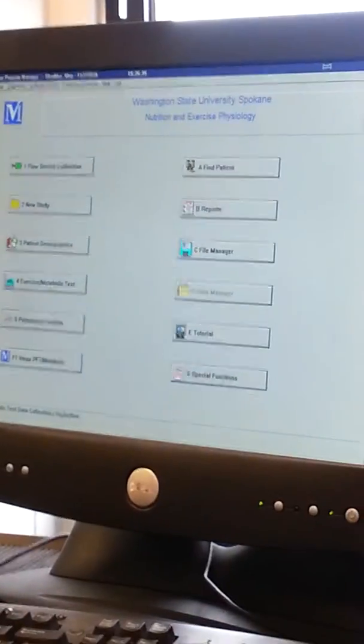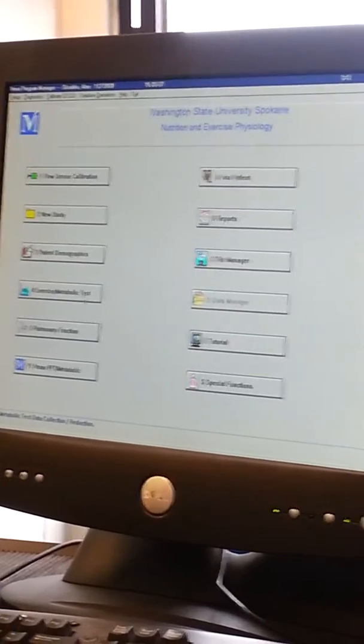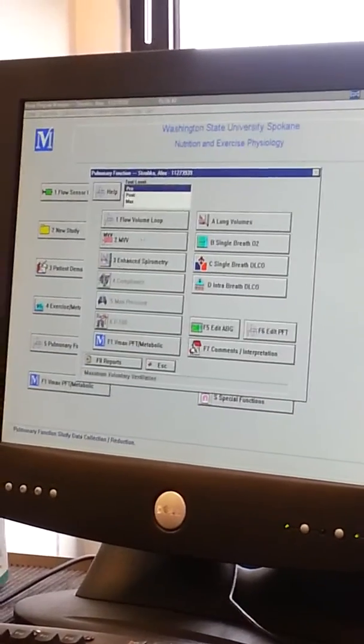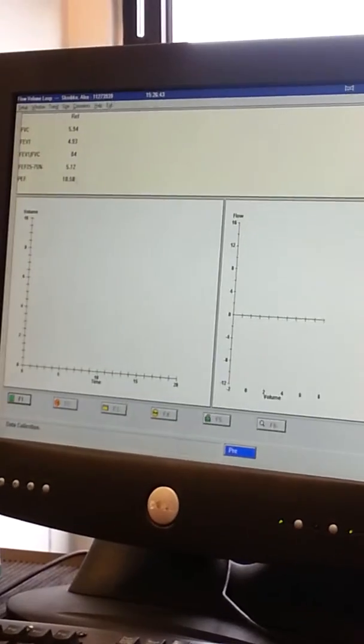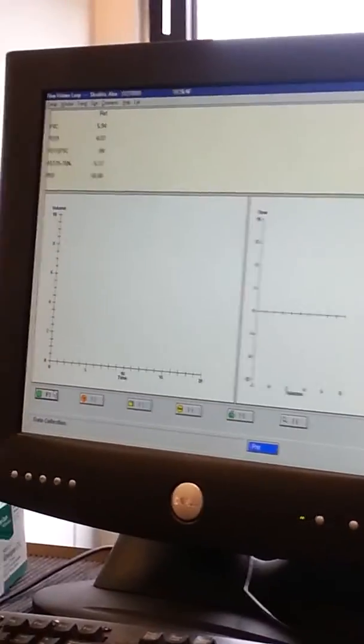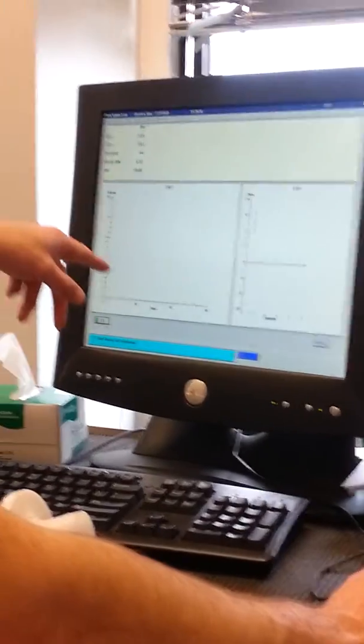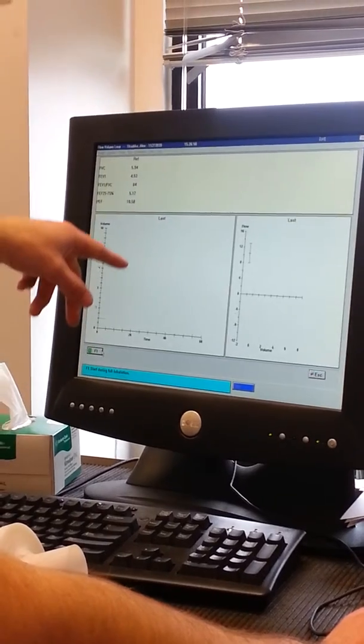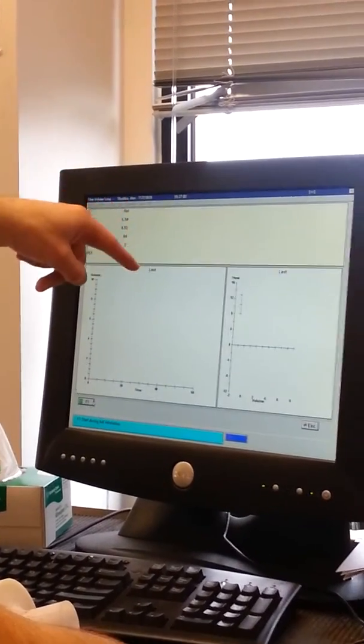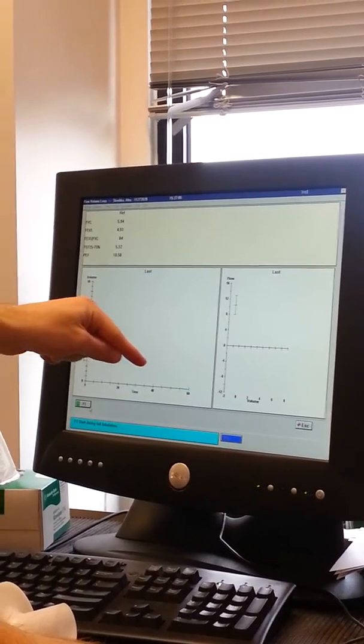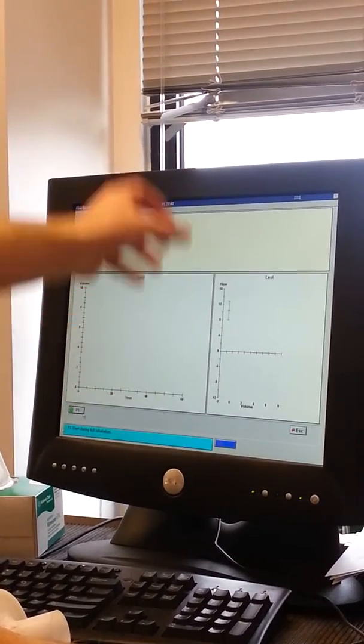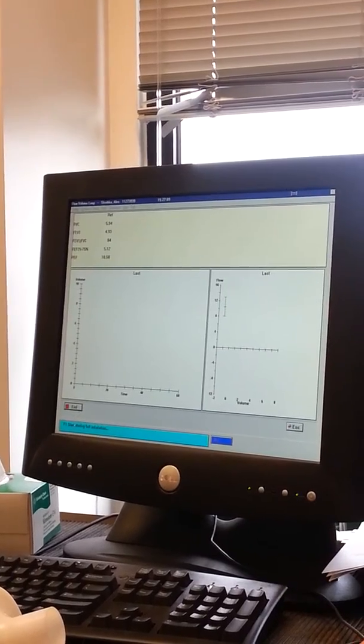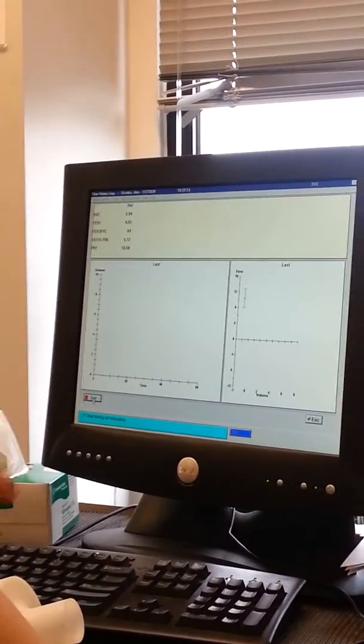Alright Alex, okay. So first things first about the breathing test - you push this to start the test. When the person's breathing, it's gonna show them breathing. This is gonna light up saying 'in test.' Perfect.